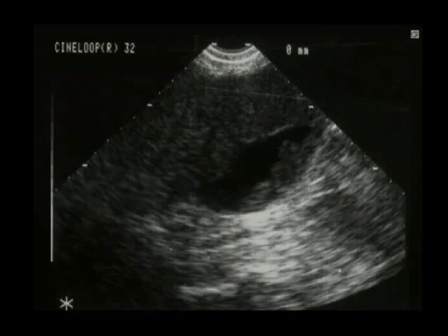Now, I will also tell you that when you look at this area, there are some areas that look almost polypoid. These are actually gallbladder polyps. But I will warn you right now, if you start seeing things like this, these are going to be really outside of our scope. We don't want to be taking the risk of, is this cholangiocarcinoma or is this a gallbladder polyp? Let someone else take that risk. Let the radiologist sort that one out. So if you got a case like this, just order a formal study.